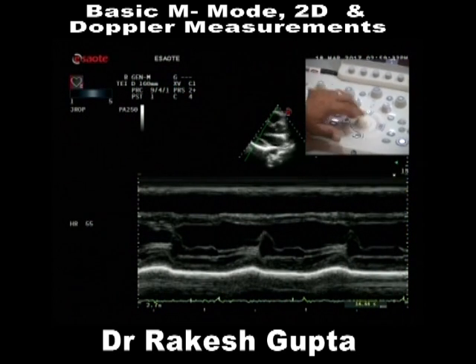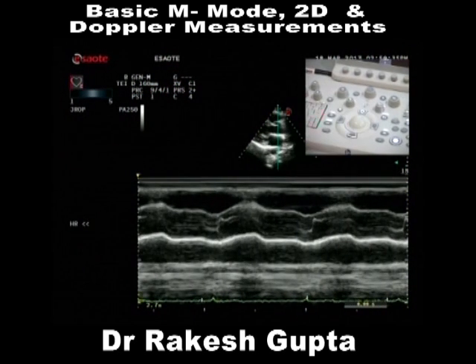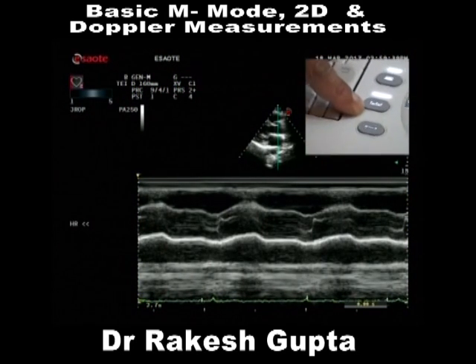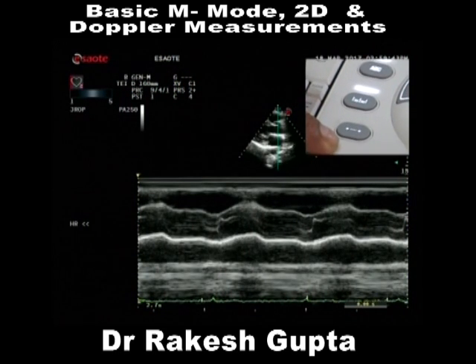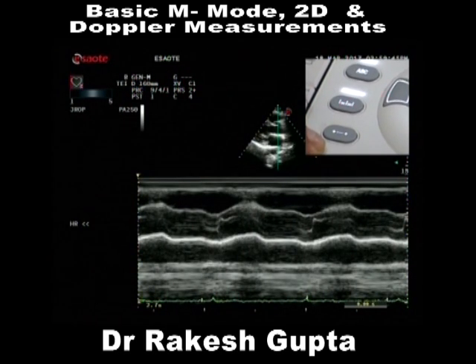Correct? So let's go back to measurements. Now in measurement, focus on these two. Zoom it up. There is one measure, one caliper. Correct? So I am going to use the caliper now.